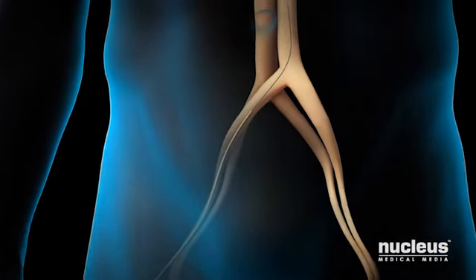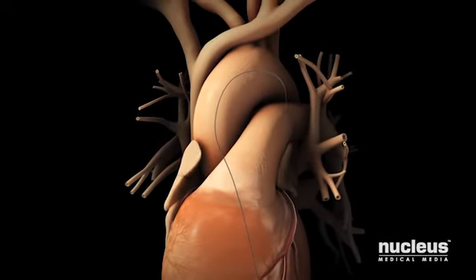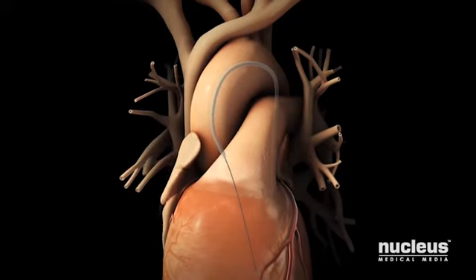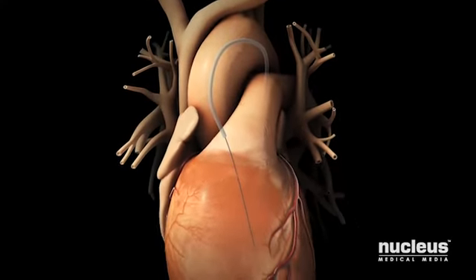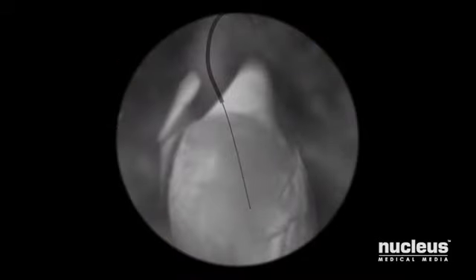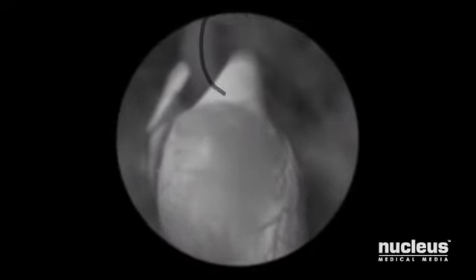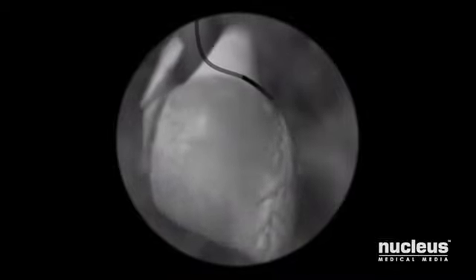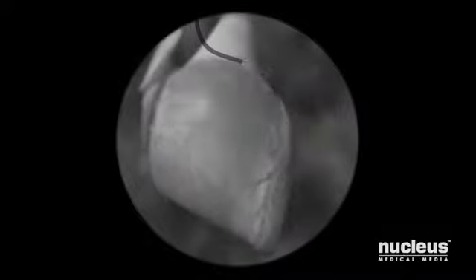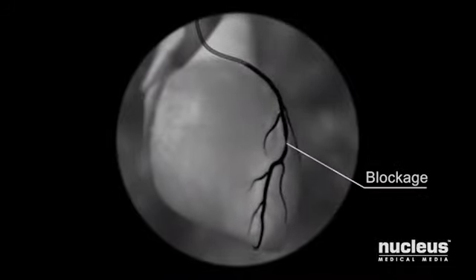Next, the guide wire will be advanced up to your heart. A flexible tube called a catheter will be advanced over the guide wire and brought into position near your coronary arteries. The procedure will be monitored using an X-ray imaging device called a fluoroscope. At this point, your doctor will remove the guide wire, position the tip of the catheter just inside the coronary artery to be treated, and inject a special dye. The dye allows the fluoroscope to see inside your coronary arteries and take X-ray images called angiograms. Any blockages will be clearly identified as the arteries fill with the dye.